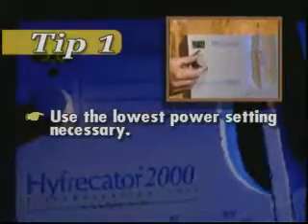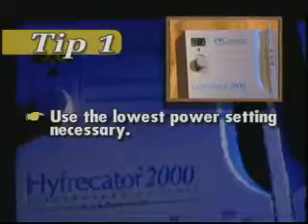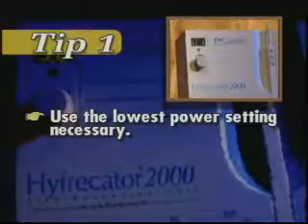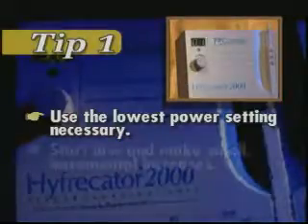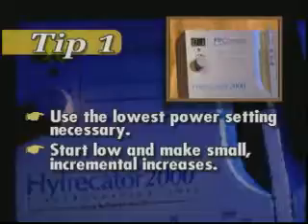Here are some tips to help you perform procedures with the ConMed Hyfrecator 2000. Tip 1. The rule of thumb with any electrosurgical device is to use the lowest power setting necessary to achieve the desired clinical effect and to provide an effective pathway for the energy to complete its circuit to ground. The same is true with your Hyfrecator 2000. You can ensure that you deliver optimal clinical effects by starting at a low power setting and then incrementally adjusting the power until you achieve the desired clinical effect.